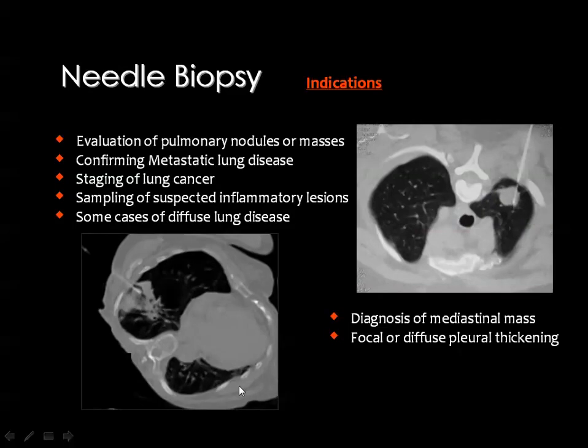Then the first technique, which is very common and is performed every now and then, is the percutaneous CT or imaging guided needle biopsy.